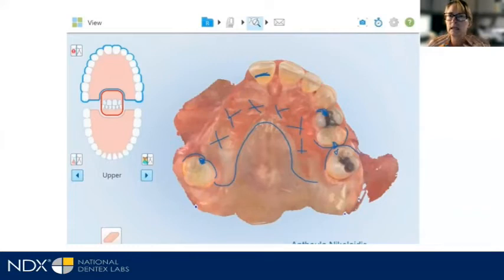When I've gone to scan fully or partially mandibular cases, if the bone has resorbed tremendously, it's very difficult to capture that mobile, flopping, moving, wet tissue. It's really, really challenging, and contending with the tongue all at the same time. Although the wand itself does a really good job of retracting the tongue, allowing you to capture the ridge, it's the movement of that tissue if too much bone has resorbed. So this is a maxillary case, and this is just a partial design that a dentist I was working with created for this particular one.